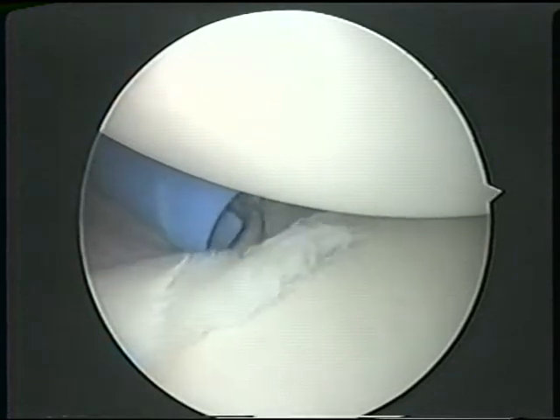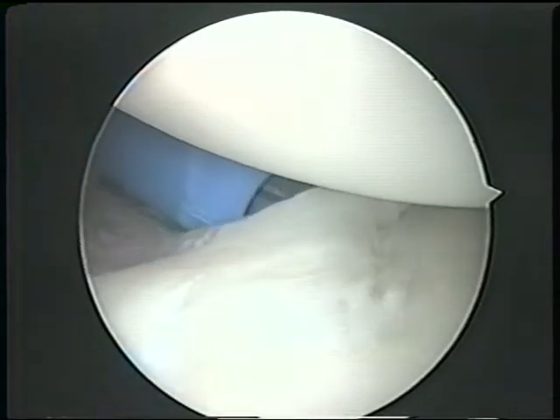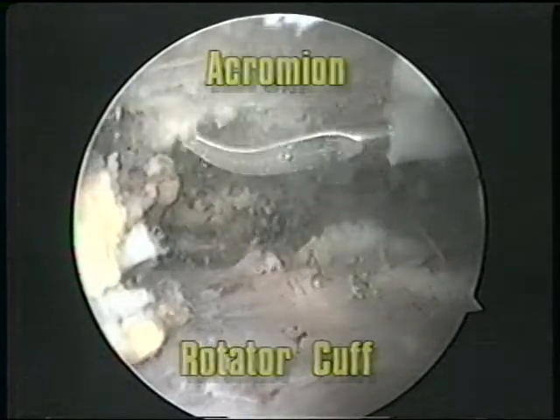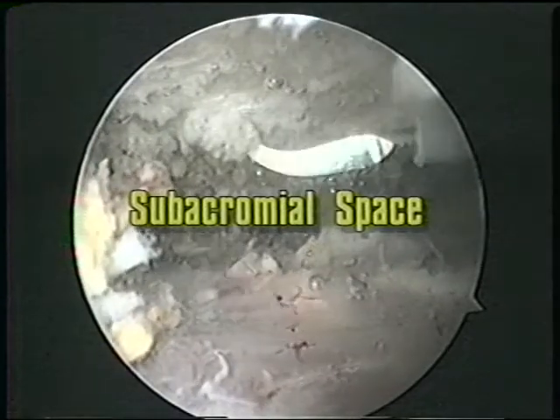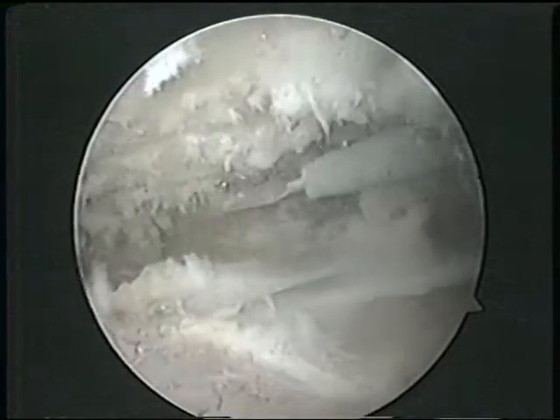Instruments are inserted into the shoulder as needed. Either the probe, shaver, or cutters are inserted to do the actual operation. The space above the rotator cuff is also inspected in some patients. This space is known as a subacromial space because it lies below the acromion bone. Here we look for evidence of impingement or tightness of the rotator cuff.